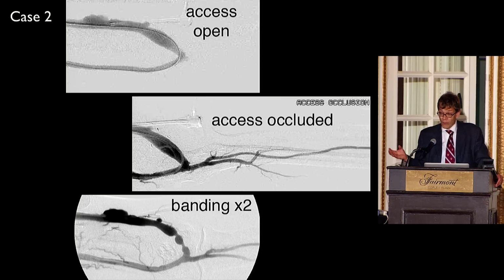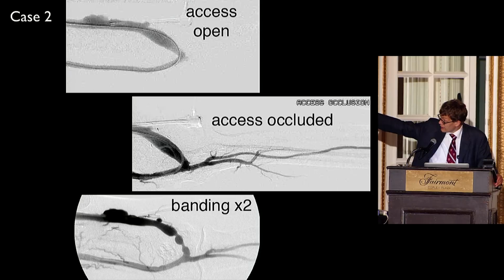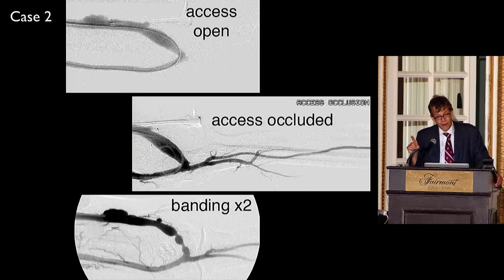An alternative approach surgically, instead of going to the brachial artery, is to hook up the cephalic vein to the proximal radial artery. That leaves the ulnar artery blood flow to the hand. So that is an endogenous way the surgeon can prevent steal, and that works. But it means that you need a little bit longer length and a slightly different surgical technique.